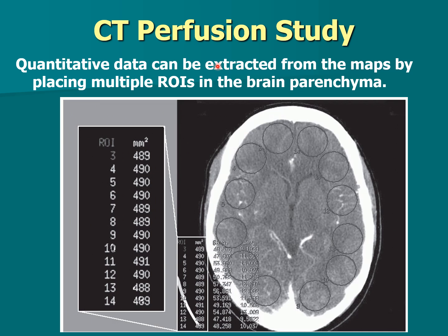A qualitative study just says that I can see that this is more dense than this. But how much more dense? I can't put a number on it. So if you're doing a qualitative study, I can just say, yes, this is more dense than this. If I'm doing a quantitative study, giving it a direct number, a quantity, then I can tell you.